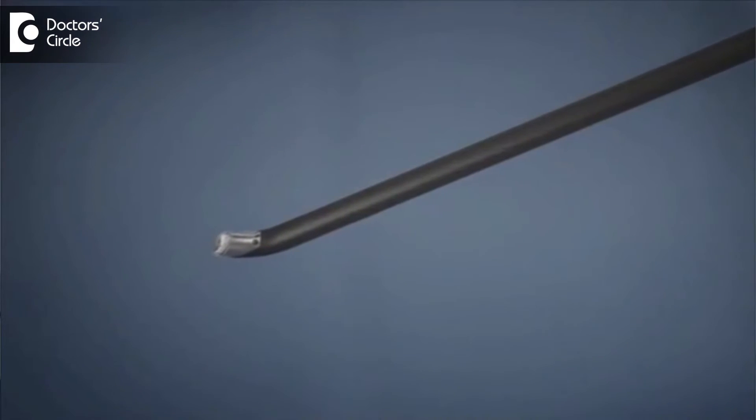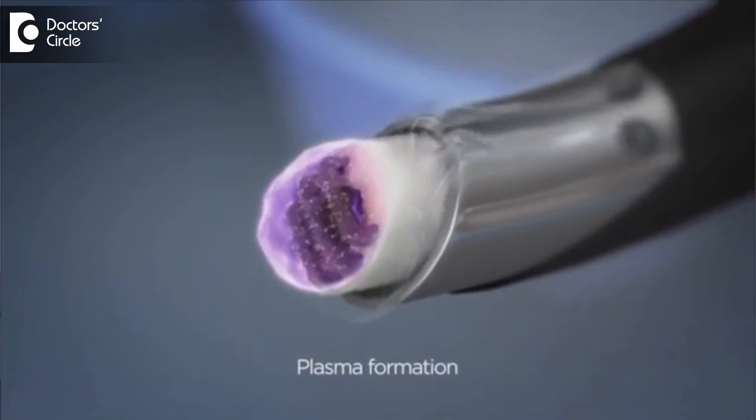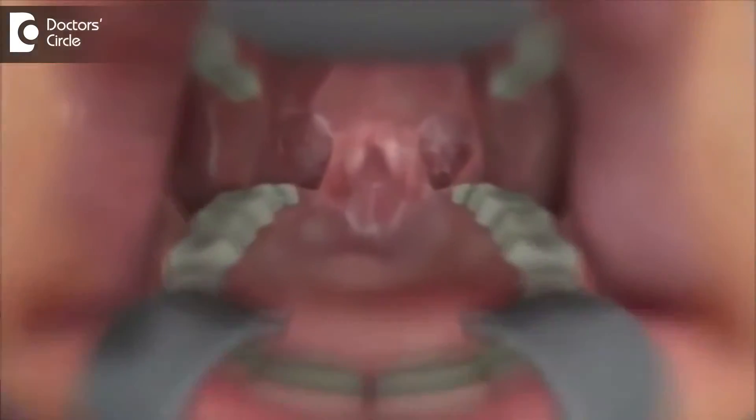Every parent panics when told that their child has to undergo an adenoidectomy — they worry about the anesthesia and about the bleeding. There is no need to panic, because coblation-assisted procedure, which is the latest technology to remove adenoids, is available in our country. In this particular method, a plasma field is used to remove the tissue, which helps in completely removing the tissue, ensuring no recurrence and very minimal bleeding. This is done under direct vision with an endoscope passed through the nose.